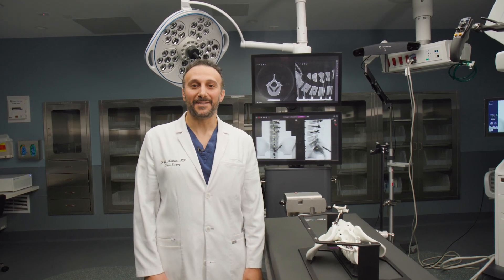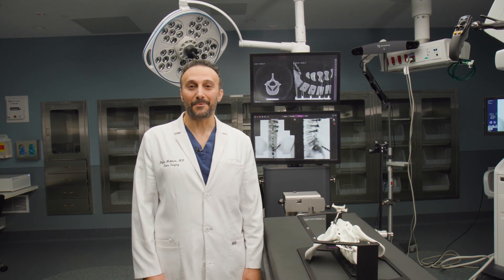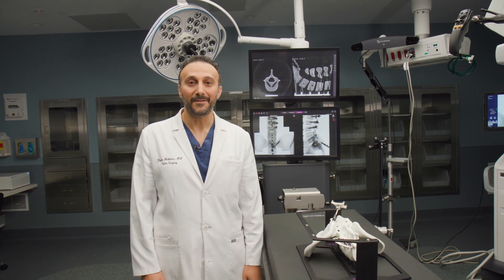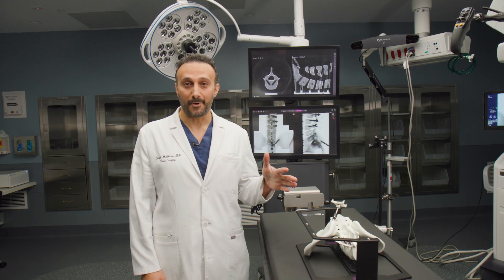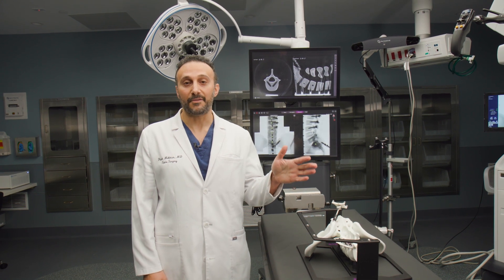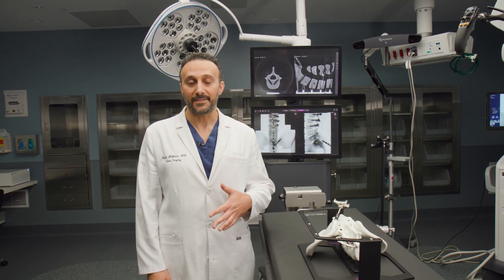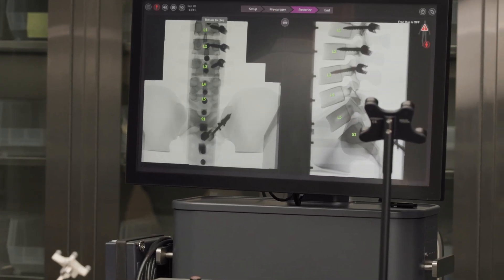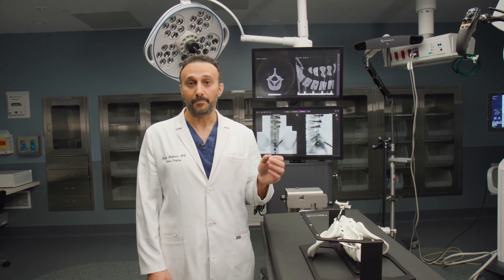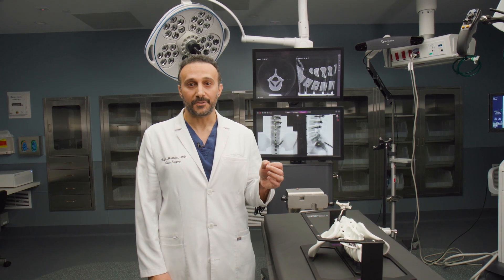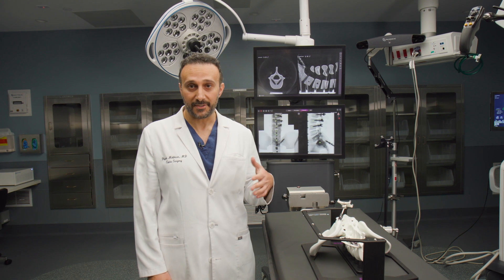Hi guys, I'm Dr. Melikian and I'm going to be giving you a demo of the Pulse Navigation platform that we have here at the Disc Surgery Center. What this platform allows us to do is use some reflective markers to give us a three-dimensional image of the patient's anatomy that then allows us to place different types of implants, screws, artificial discs, and that kind of stuff into a patient with improved accuracy, and that allows us to perform more high acuity complex cases in an outpatient center.